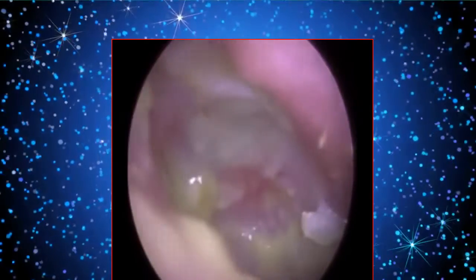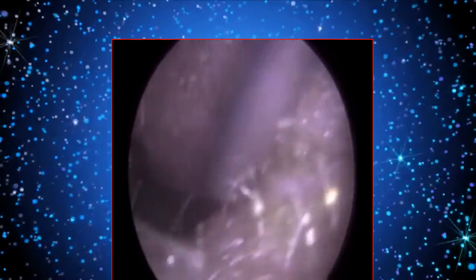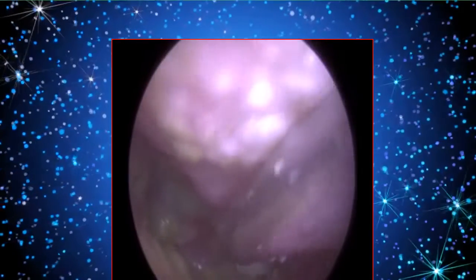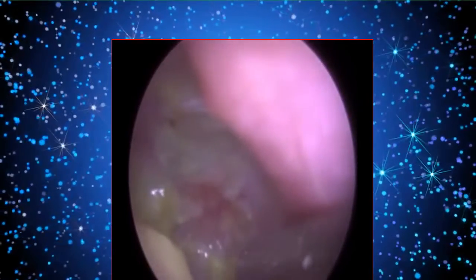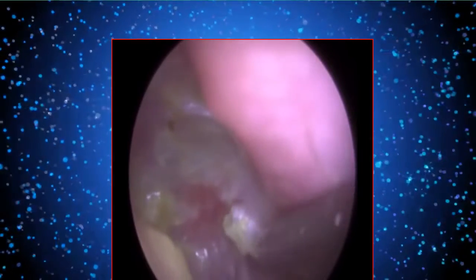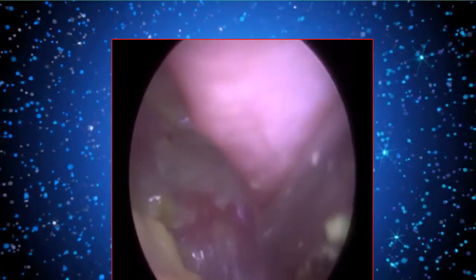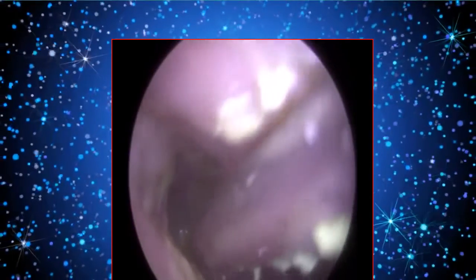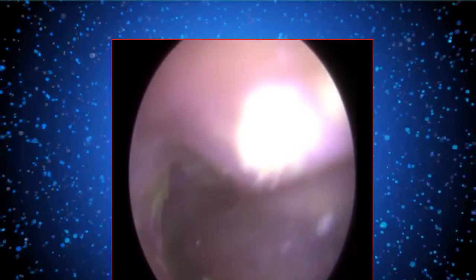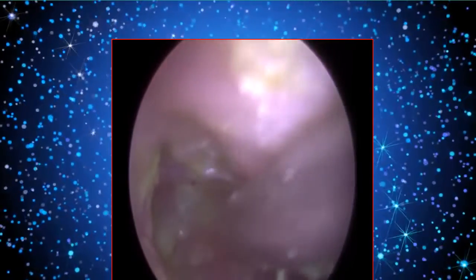And there's the patient's tympanic membranes. It's still difficult to visualise because of the swelling, but I can see the handle of malleus. The eardrum itself is slightly inflamed. The patient also had glue ear, otitis media with effusion. So you could hear a lot better than when he first came in, but his hearing still wasn't 100%. Not only because of the swelling, but there was some fluid behind the eardrum called glue ear, otitis media.